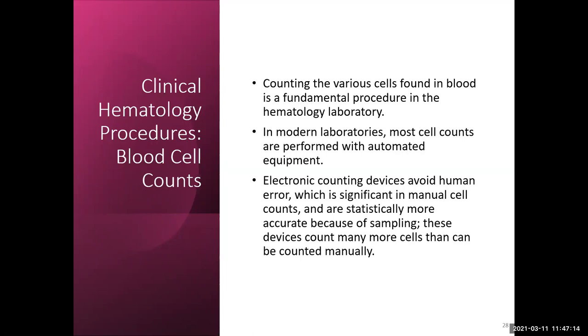And what's so funny is you'll run a sample through an analyzer and you send the results out. Everything's normal, the differential's normal. And you'll have a doctor that calls and says, I want you to do a manual differential. So they actually want you to take it, make a slide, look at it under the microscope. And you do the manual differential, it's the exact same thing.